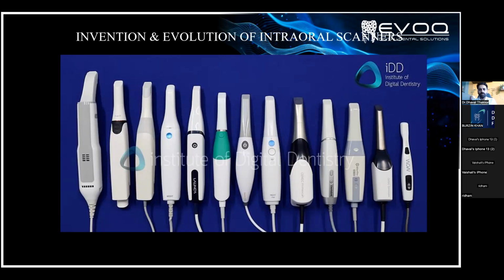There are three major factors which should be considered before buying an intraoral scanner. First thing is the budget. Second thing is the scan speed, and third thing is the openness of the scan software. Premium category scanners are far better than the economic ones if we compare the scanner speed as well as the scanning data accuracy. But the economy scanners are also doing good.